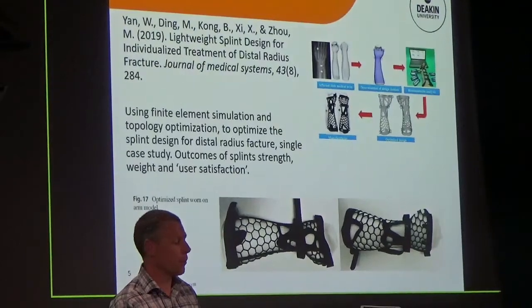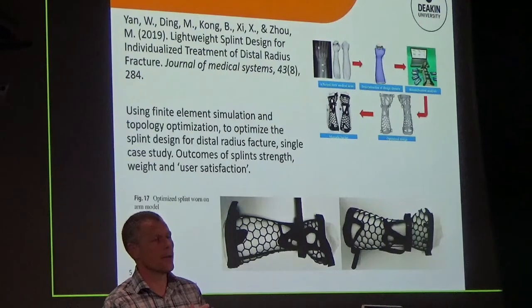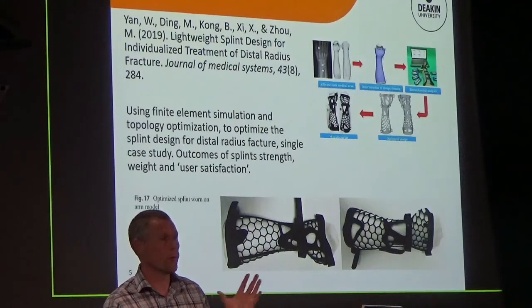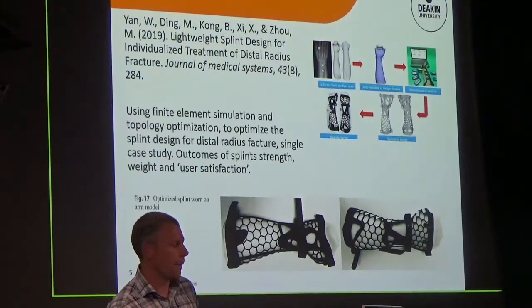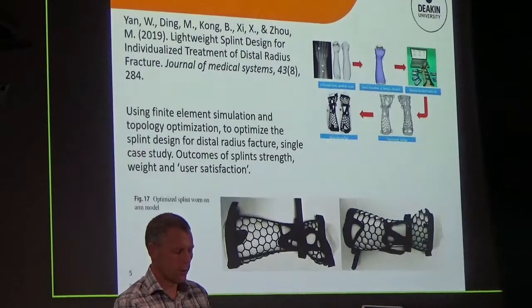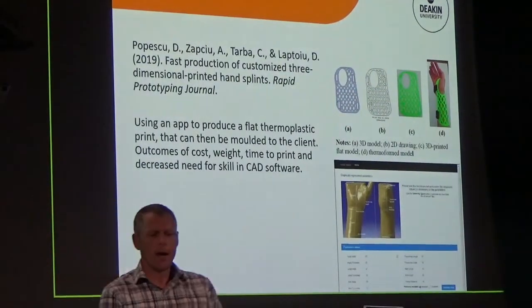That's what they came up with, that black design at the bottom. So that is a splint that has been printed and used that is the same equivalent strength as a full cast. So you can see the possible benefits. Their outcome measures are very across the board, a bit loose might be a term. So they're not that strong.